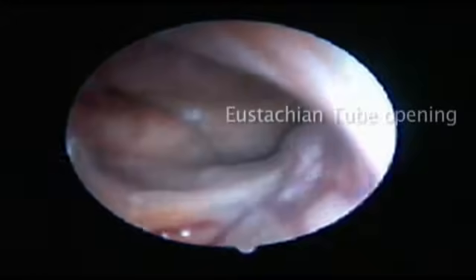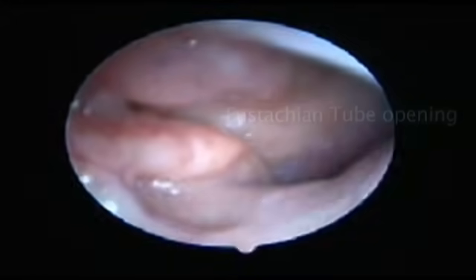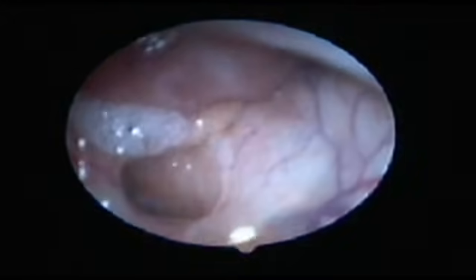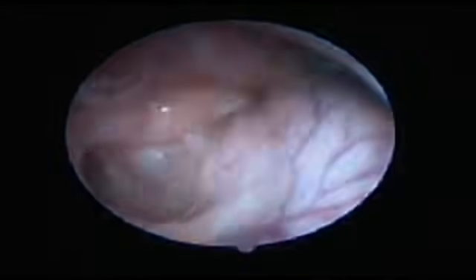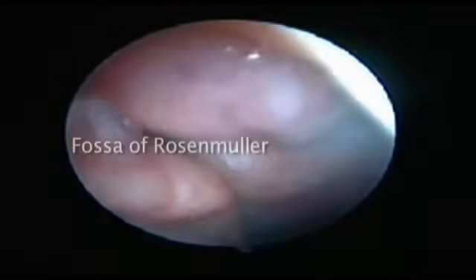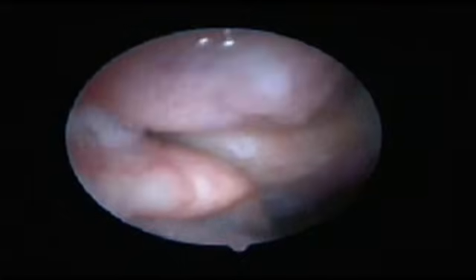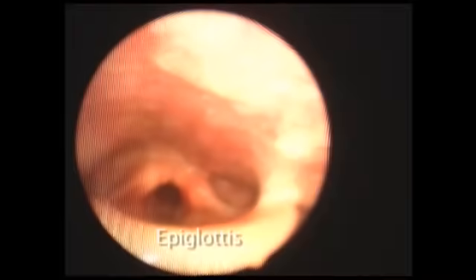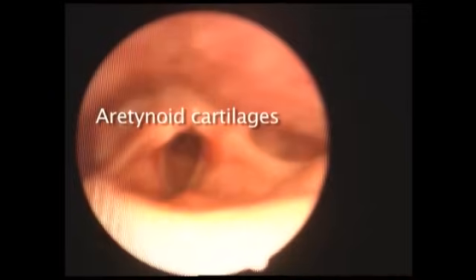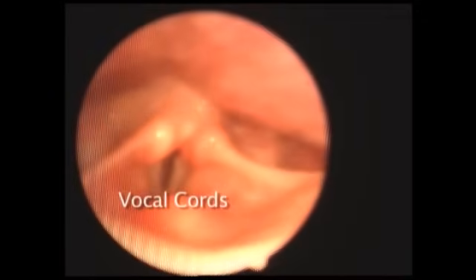The scope is then passed into the posterior part of the nose, where you can see the eustachian tube opening, and the fossa of Rosenmüller. Passing the scope even further back, you can see the epiglottis, the arytenoid cartilages, and the vocal cords.